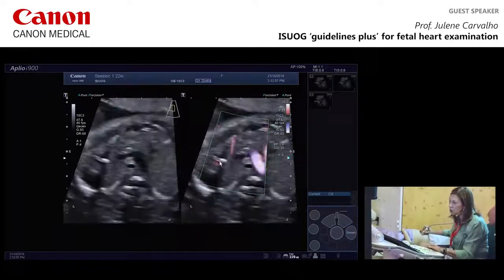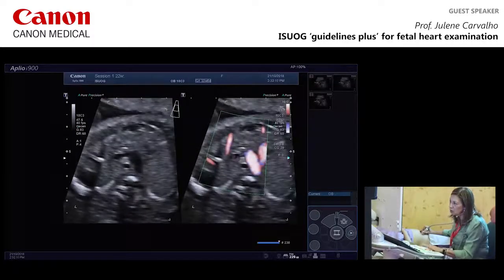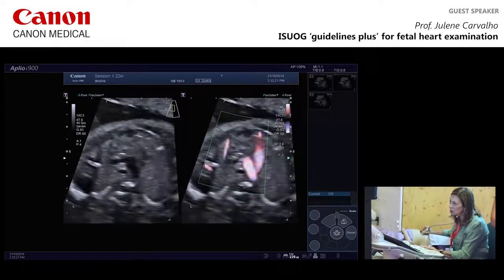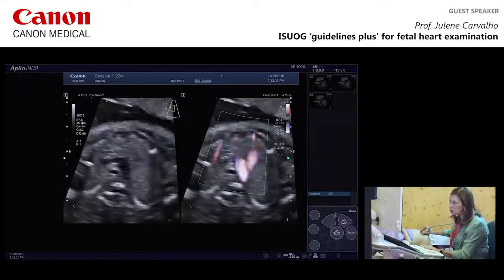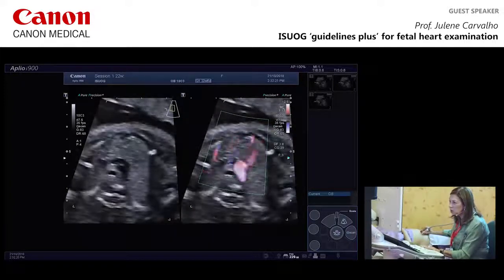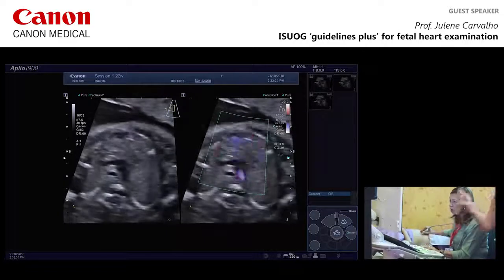Can you see that flashing here? Yeah, that's the thymus. You see the stopping here? That's one internal mammary. That's the thymus area. That's the other one. And you can see here it's going to come from the subclavian artery. Quite nice there. So that's compensating for some of the shortcomings with the slide.